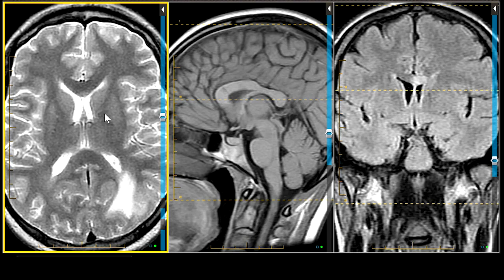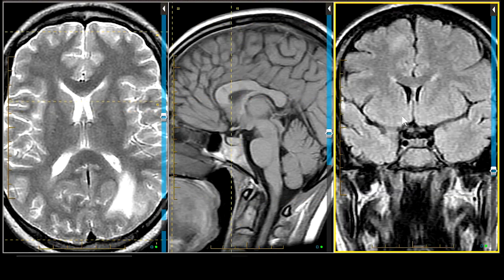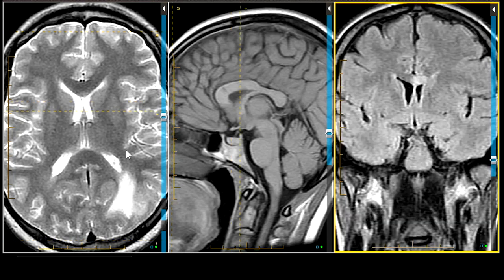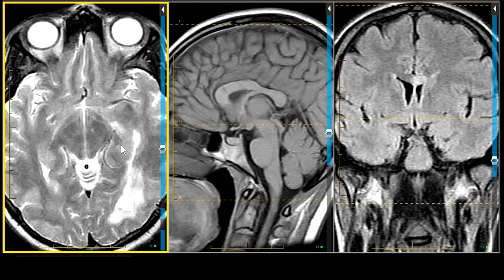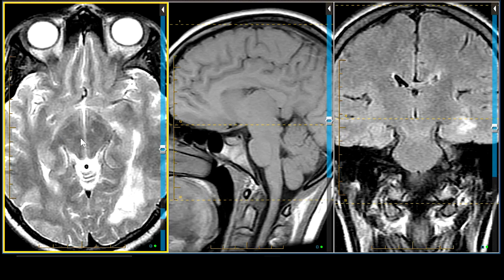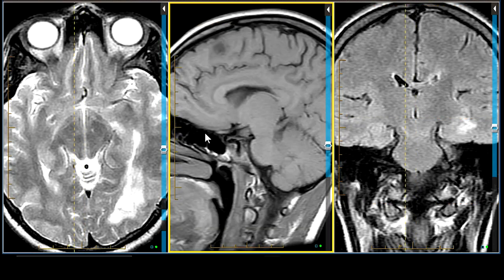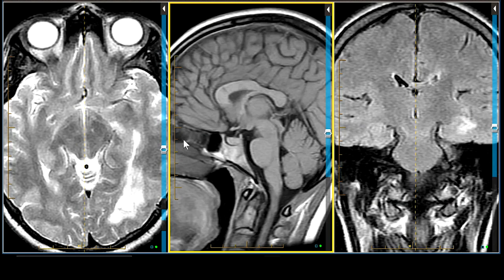These are associated with structures such as the subthalamic nucleus, which we see below the anterior commissure. A little more anterior, we still see the subthalamic nucleus region, and the substantia nigra. In this young individual with tumefactive MS, the substantia nigra is nicely seen as a somewhat darkened stripe. In Parkinson's disease, we look for loss of this stripe in the outer aspect — the so-called swallowtail sign. Another thing we look for is to separate the round dark signal of the red nucleus from the region of the substantia nigra by this stripe; when they bleed together, this is usually a sign of Parkinson's disease.